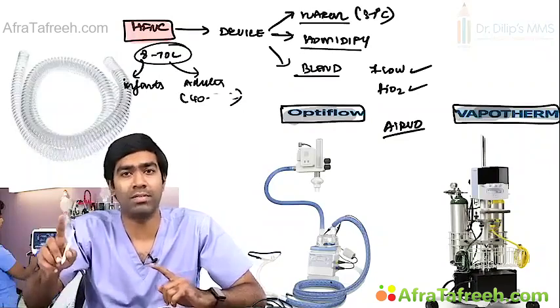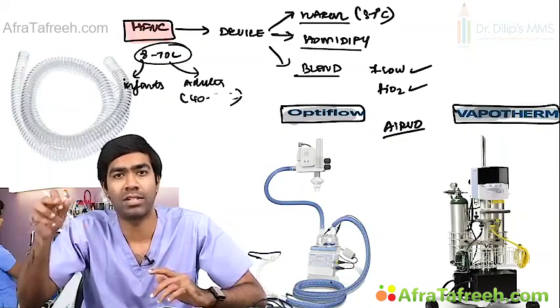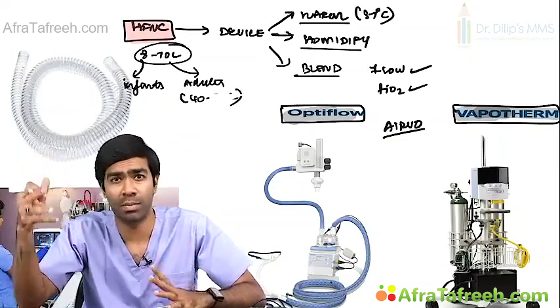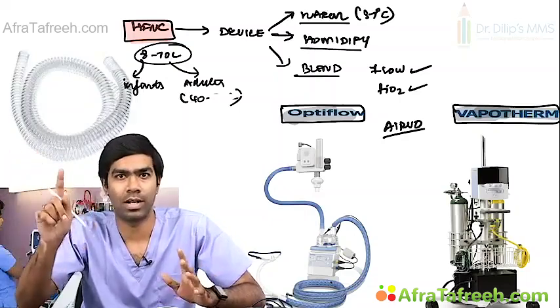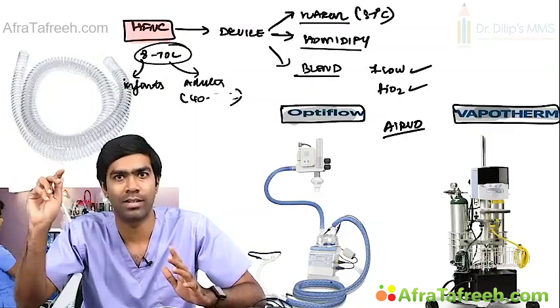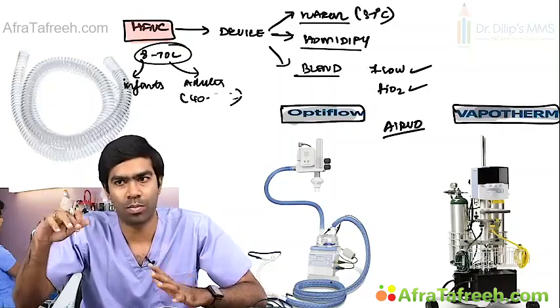The patient might be suffering from some serious disease, lung or cardiac disease, but with this HFNC, the patient looks apparently much better, well perfused, good saturation, they'll be comfortable. Discharge the patient, you're dead. Not you, the patient will be dead. And indirectly, you are dead as well. So don't do that. So that's one problem with this HFNC.